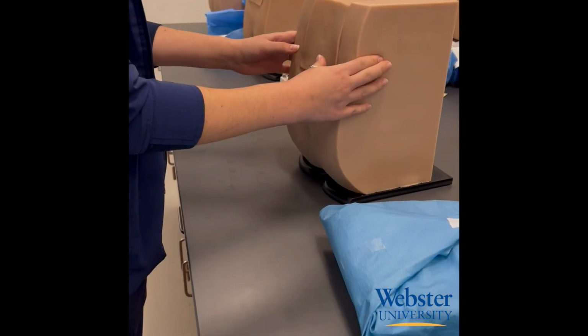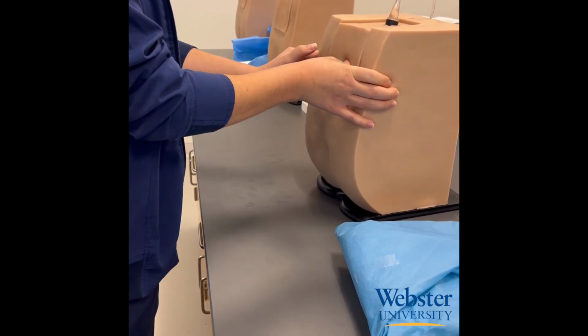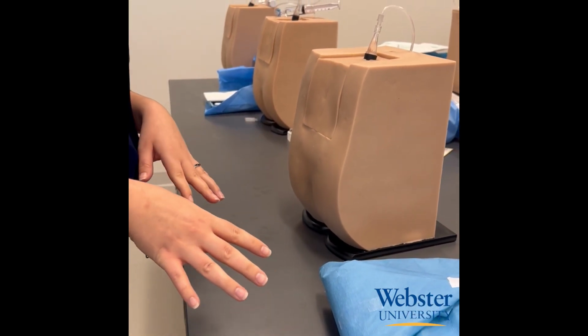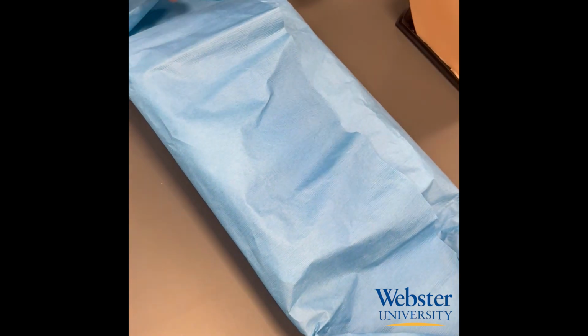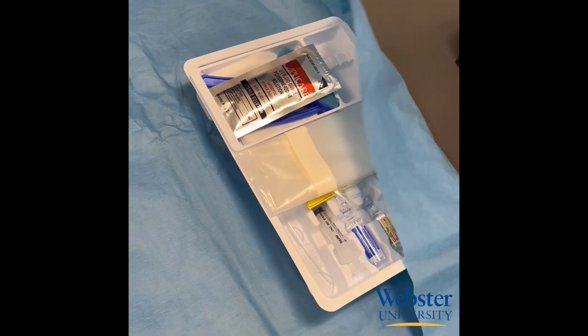Once the spot has been identified and I know where I'm going to puncture the skin, I mark it and then start setting up my epidural tray. First, I open up the sterile cover in a way that keeps the inside sterile, and then I'm going to put on my sterile gloves.